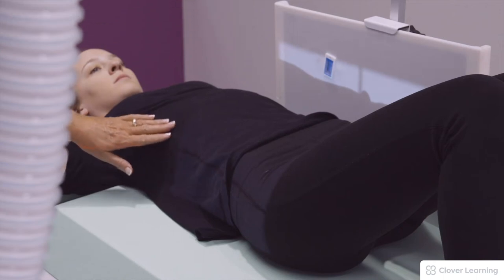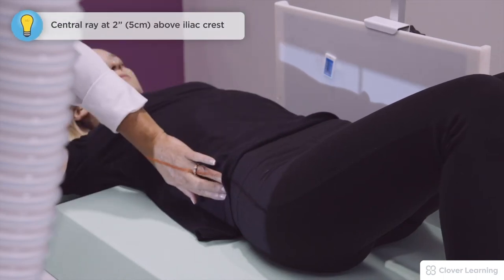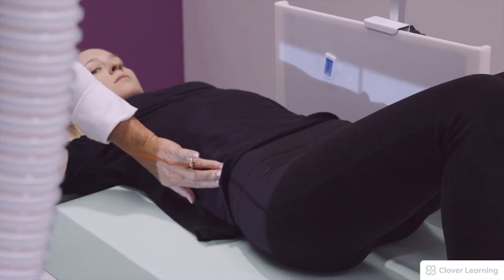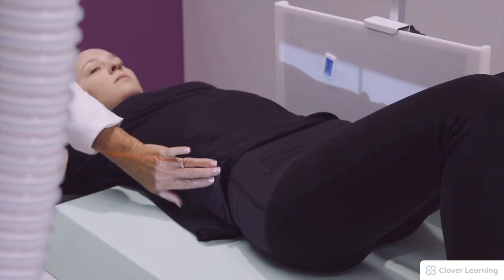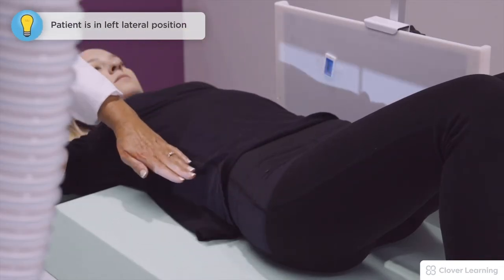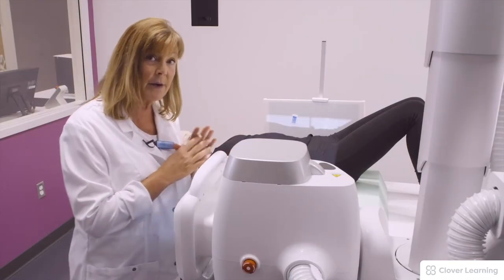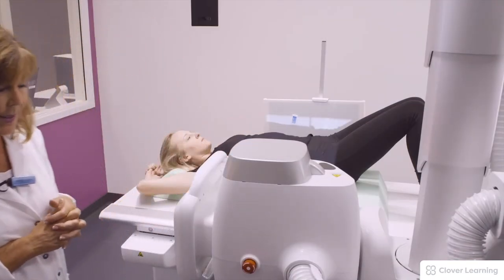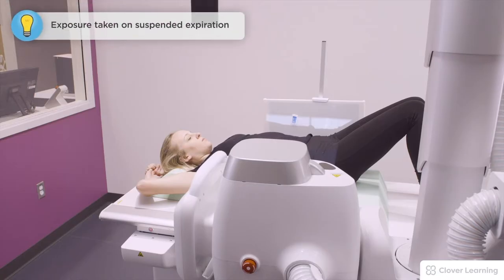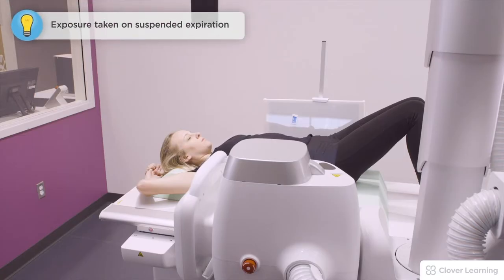We have her on her back with the central ray at two inches above the iliac crest. Her left side is closer to the IR, so I've indicated that with a left marker. The patient will take in a very big deep breath, blow her breath all the way out, hold very still.